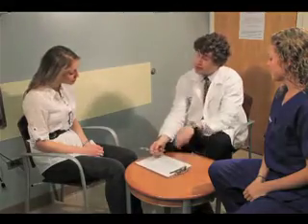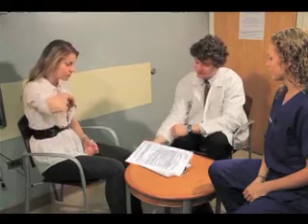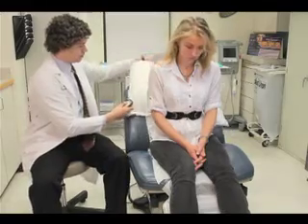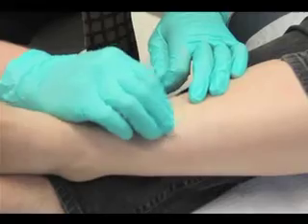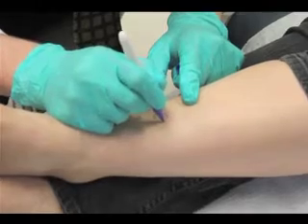When performing any medical procedure, it is important to educate the patient regarding its indications, risks, and benefits. After answering any questions or concerns the patient has, formal written consent must be obtained. Following appropriate timeout protocol, verify the biopsy site and side with the patient. To optimize the performance of a punch biopsy, have the patient recline on the examination table. Begin the procedure by cleaning the area with an alcohol swab. If the lesion is poorly demarcated, it can be outlined with a skin marking pen before the procedure.